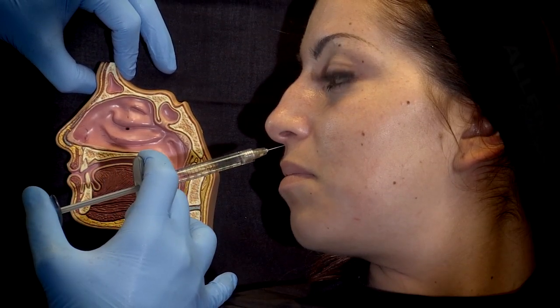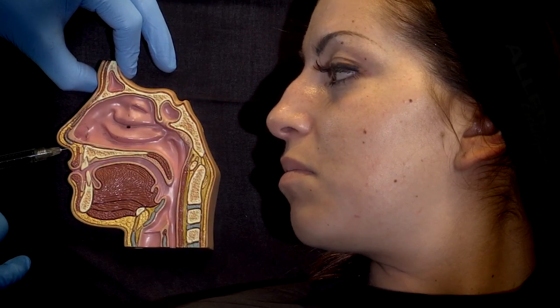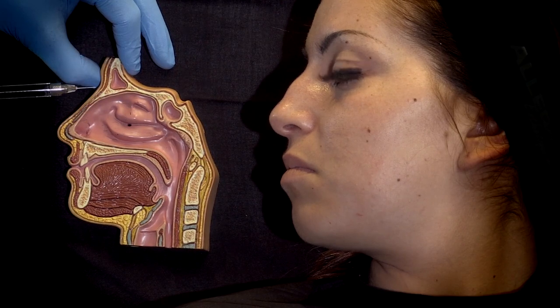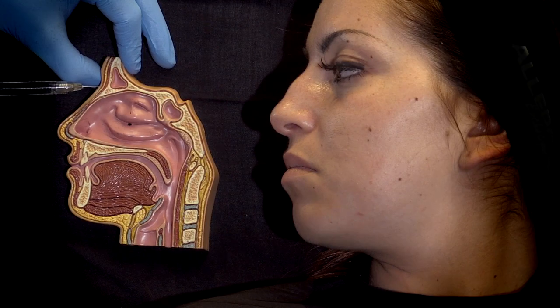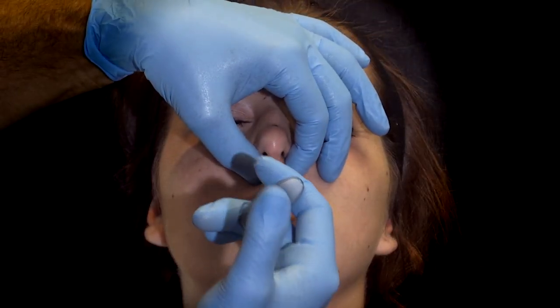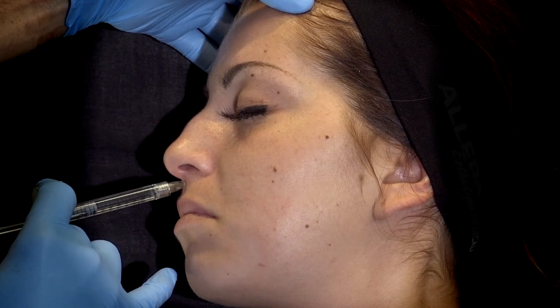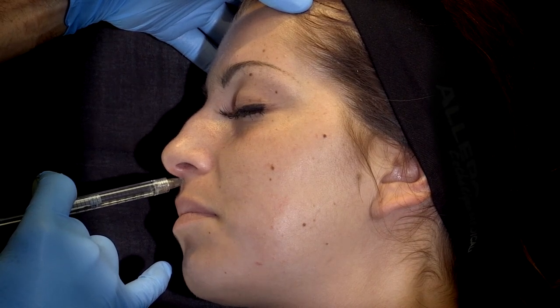We usually start with the injection deep on the nasal spine to lift the tip. And then we will inject the naso-frontal angle down to the bone. The injection is medial with a slow anterograde and retrograde injection down to the nasal spine. The lidocaine, if you inject slowly, has time to numb the area.